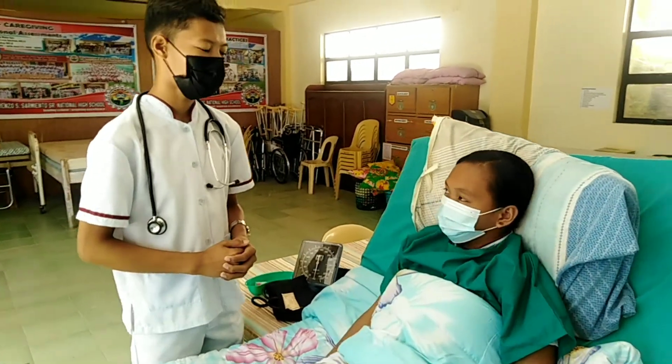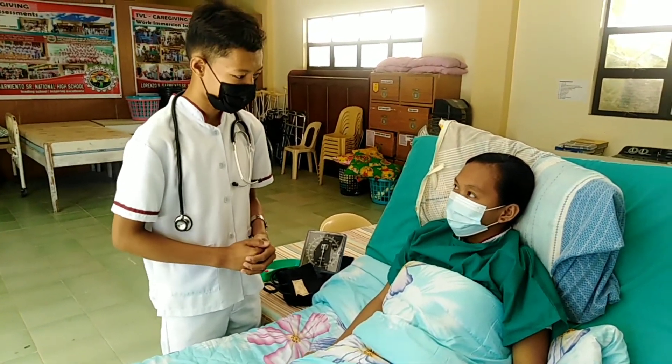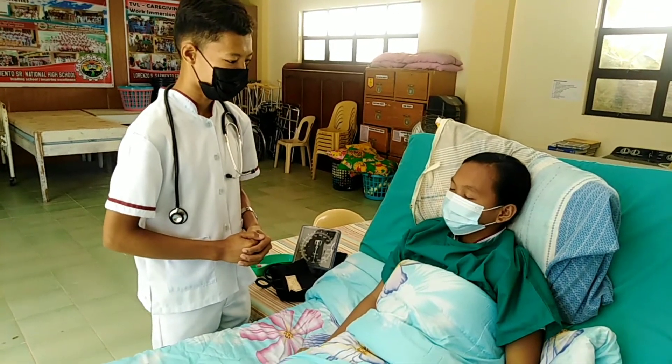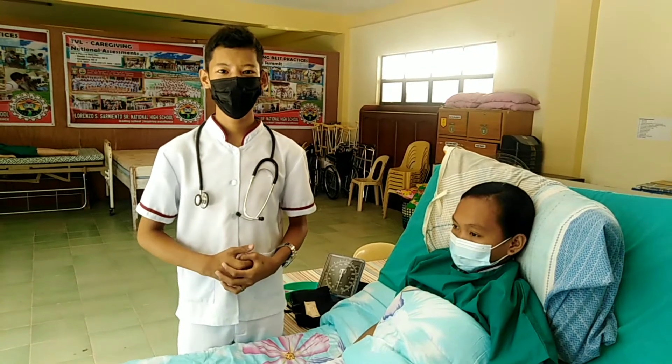Good morning ma'am. My name is Jolan Fernandez Filima, your caregiver for today. May I know your name ma'am? So I'm here to take your vital signs. Is it okay ma'am? Yes, sure.